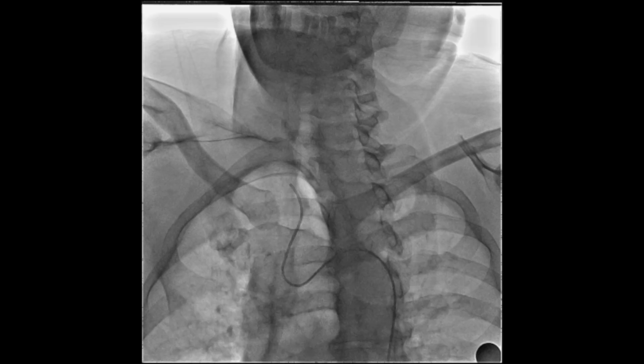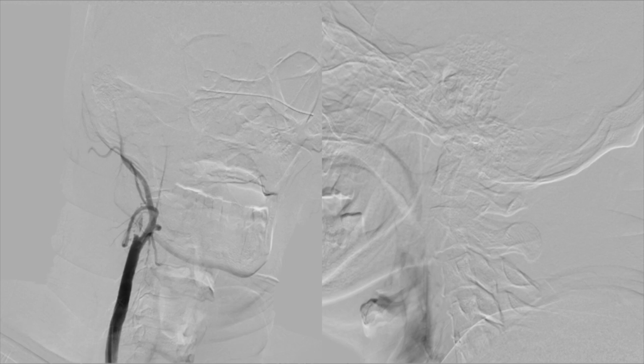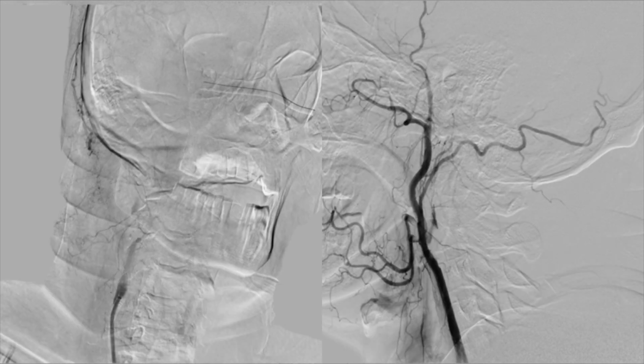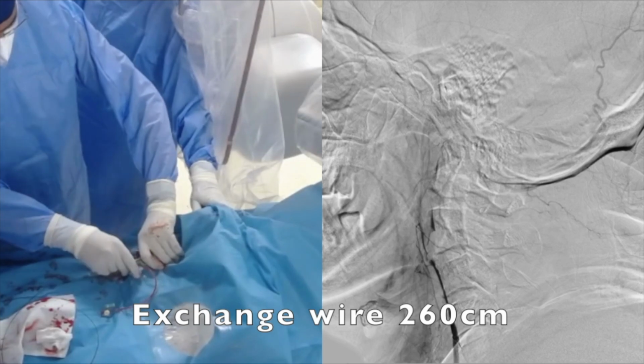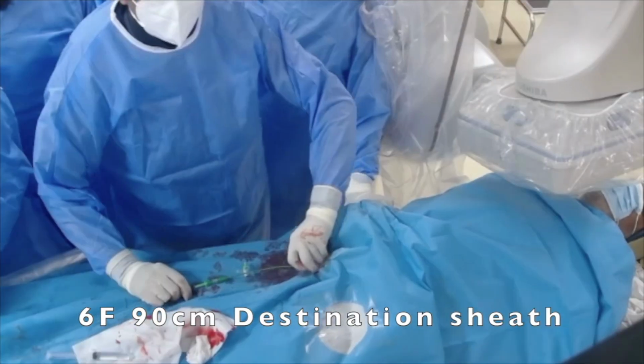Carotid angiogram confirmed right ICA occlusion. On RAO view, a small stump can be seen, but on the lateral view, it was difficult to judge the exact entry point of occlusion. 260 centimeter exchange wire taken and 6 French small femoral sheath exchanged for destination sheath 6 French 90 centimeter.